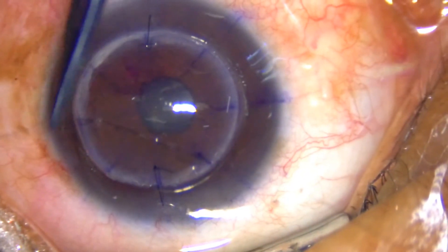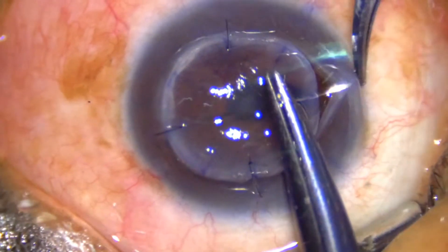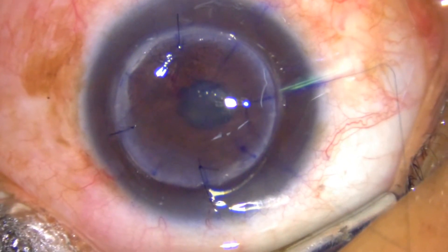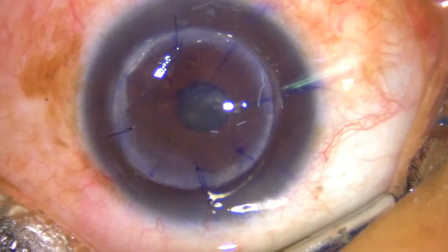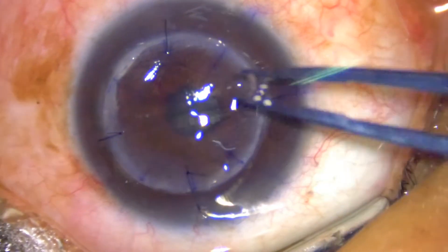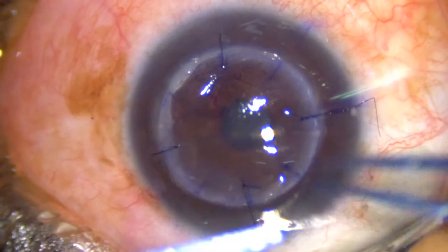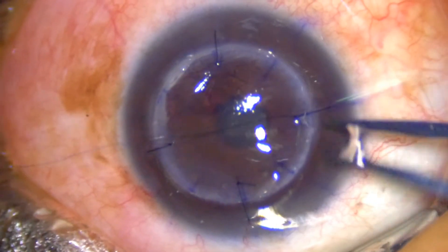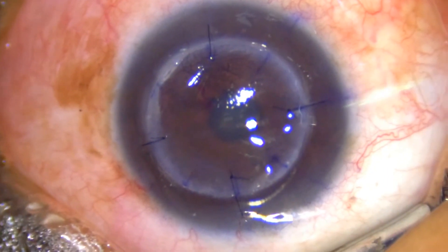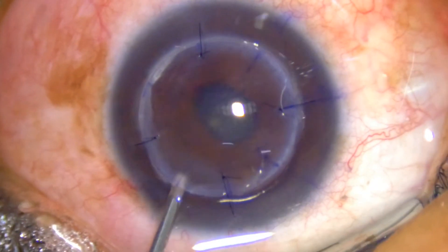As I have completed my four sutures, the anterior chamber is quite well formed. For the first four sutures I usually keep viscoelastic material in the anterior chamber and then wash it off and form the anterior chamber with BSS and an air bubble. This air bubble will act as an intraoperative tonometer for me, guiding me to take the sutures and decide the tension while tying them.